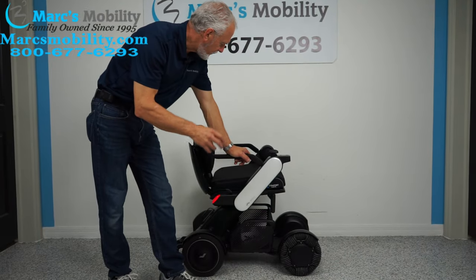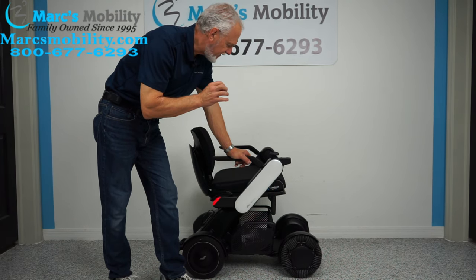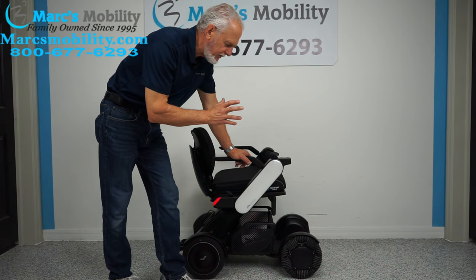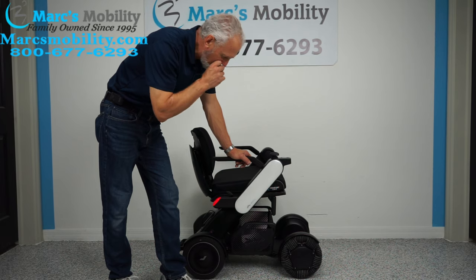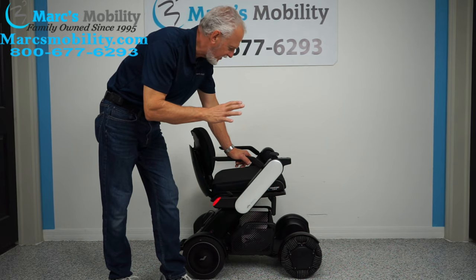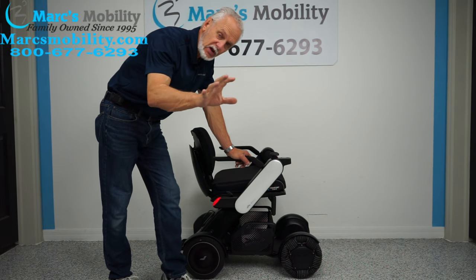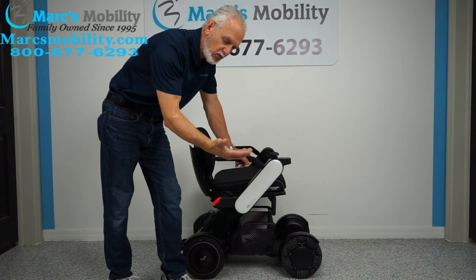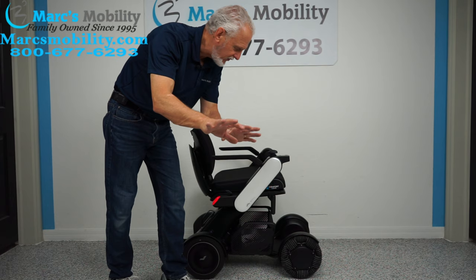Hi folks, we have here the Will Power Chair — this is a CI2 Will Power Chair, a new power chair on the market that's only been out for a while. This power chair has all kinds of features you're probably going to like. If you have a loved one and you need to drive the chair for them, you can walk with your phone next to the chair and drive it from your phone. We'll show you that in a few minutes.